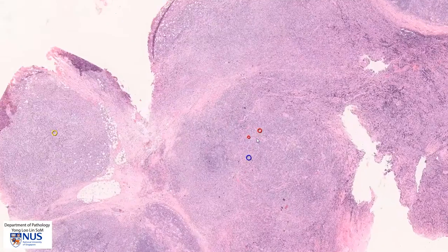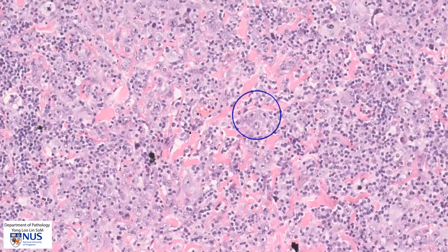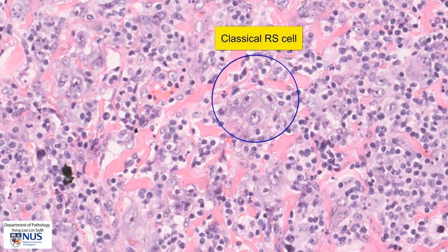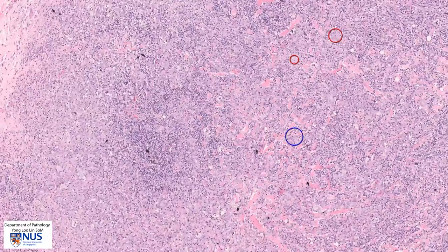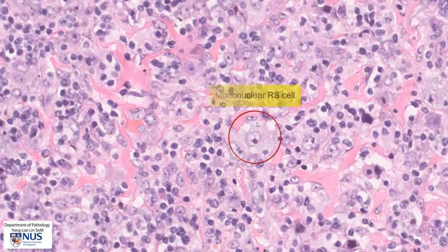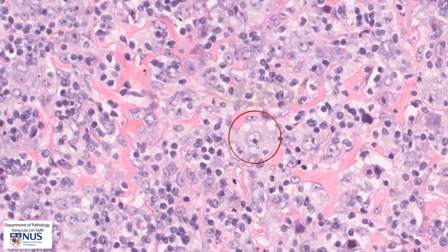Let's have a look at some of the Reed-Sternberg cells. Here is an example of a classical Reed-Sternberg cell which is binucleated. The cell itself is very large, containing large nuclei with macronucleoli. If you compare this nucleolus with the size of a small lymphocyte, you will see that it is actually as large as a small lymphocyte. Here we also see a mononuclear Reed-Sternberg cell with only one nucleus but still with that macronucleolus, and again this is a very large cell in comparison to the small lymphocytes around it.